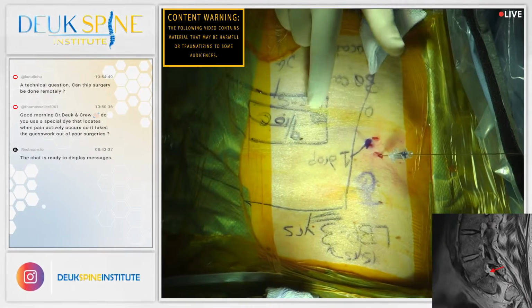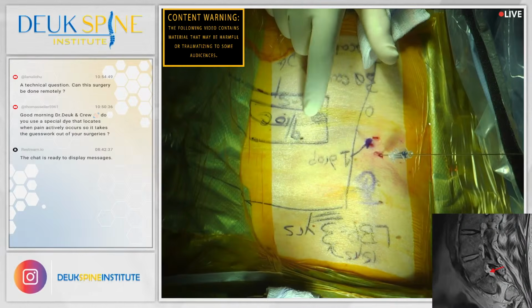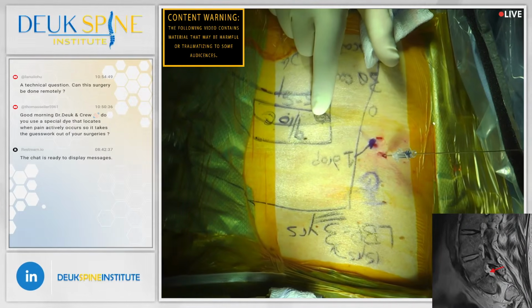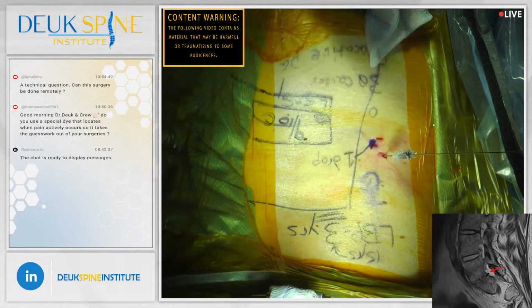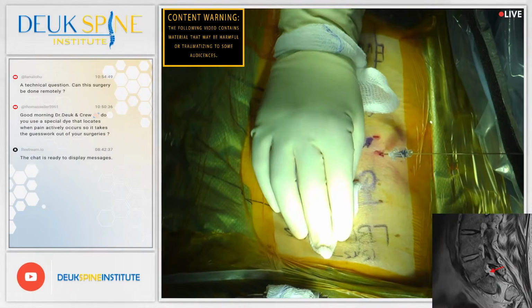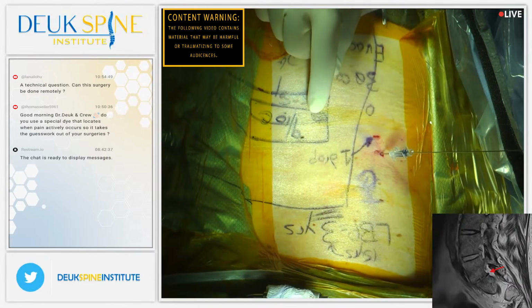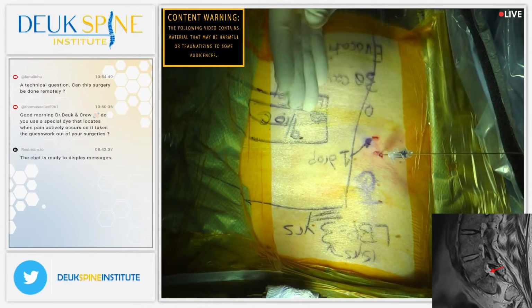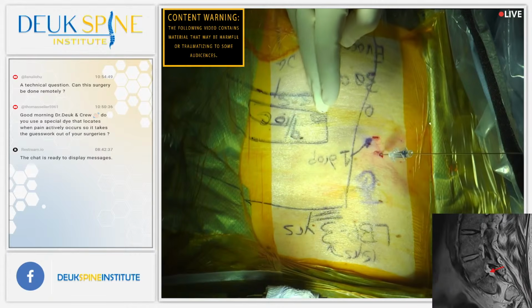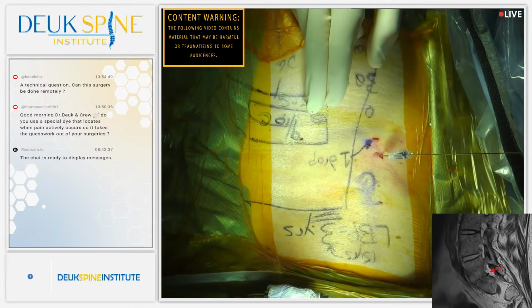Now, this back pain he has is literally coming from a small tear the size of a pea on the back of his disc at L5-S1. I'm going to go in with a laser and clean that tear. Can you count out loud from 1 to 100? Count out loud. So once I clean the tear with the laser, get rid of the inflammatory tissue in there, which is the cause of his pain, get rid of the herniation stuck in the tear, which is the cause of the inflammation, that pain will be gone. He'll wake up and that pain is not going to be there anymore.